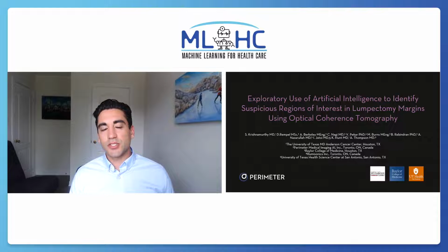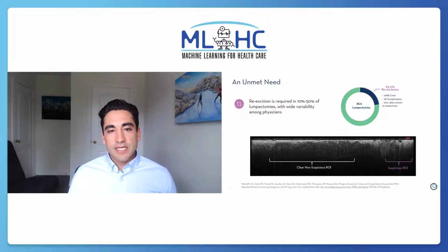Welcome to my presentation on how we are using AI to identify suspicious regions in lumpectomy margins using optical coherence tomography. There is a critical unmet need in breast conservation surgery. Currently, between 20 and 30% of breast lumpectomy procedures require a second visit for re-excision of positive or malignant margins.